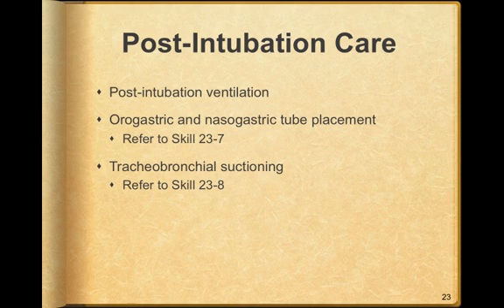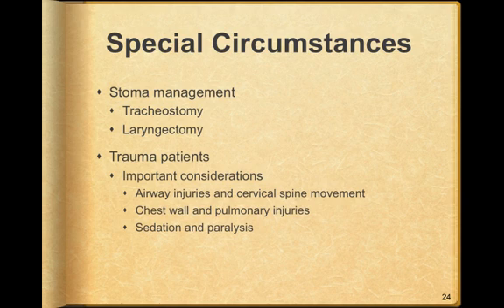Tracheobronchial suctioning is also important. After we facilitate an intubation, we might actually have to send down an endotracheal suction catheter to remove particles, food particles, mucus, and whatnot. Special circumstances.